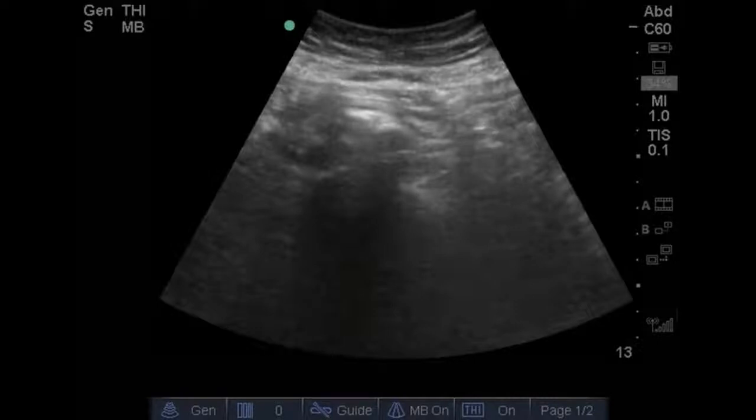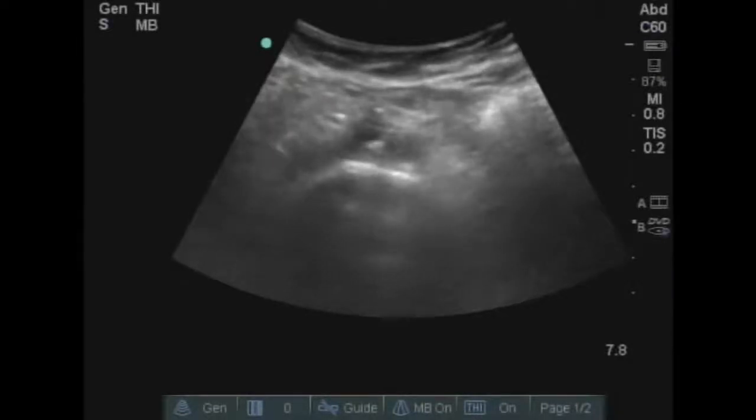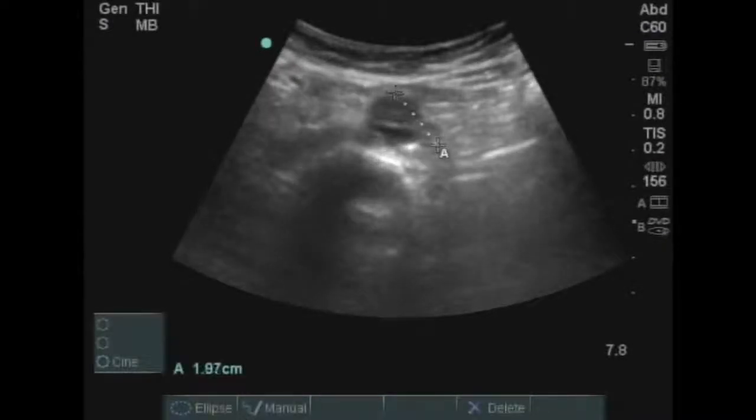And here you can see the aorta has bifurcated into the right and left iliac arteries. If you come just proximal to that, that would be the end of the distal aorta, and you can measure there. Once again, we see the abdominal aorta branching into the iliac vessels, and we come just proximal to that to measure our distal aorta. And you can see here, once again, outer wall to gain your aortic measurement.